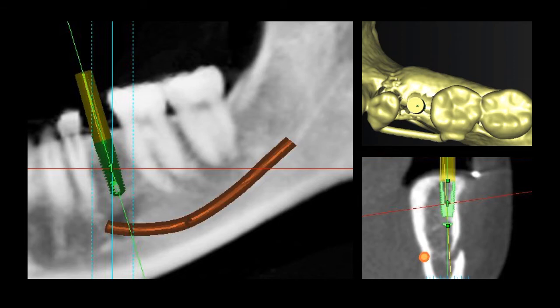We had the software add an abutment on top of this implant so we can position the implant appropriately in the center of the site to be in occlusion properly and to be in the line that is connecting the central fossae of the molars and premolars. As we can tell from the upper right-hand side picture, I placed the abutment right in the center of this line that connects the central fossae of number 18, 19, and 21.